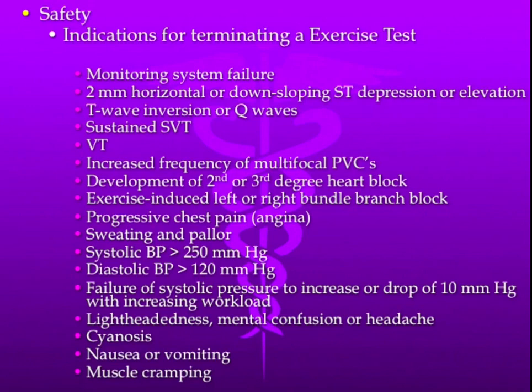Indications for doing a test, the reason why I don't have a slide dedicated to that is because there is no real clear picture of why. A lot of times this test is done in research or in bigger institutions. Certainly if they have significant COPD, if they have a cardiac function abnormality, exercise, they're athletes. There's a lot of reasons you might do this, but there's no real clear-cut indications for doing this test. It is expensive, and not every institution can do that.